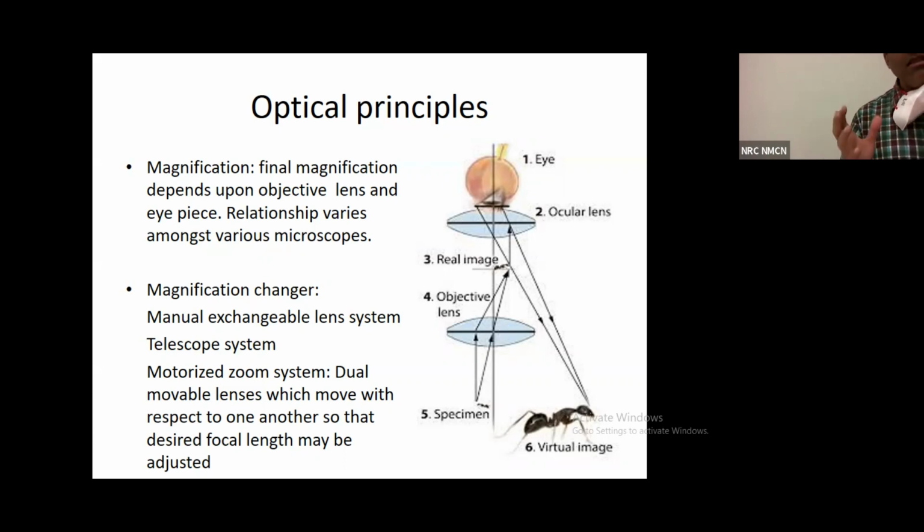Now, there are ocular aids that provide fixed magnification, which ENT surgeons and plastic surgeons use, known as loupes. I don't know whether you have seen loupes or not. It is simply a pair of specs, and there are two lenses fit onto the glasses. But the problem with them is that it is a fixed magnification. It can magnify to 1.2 or 2 or 2.5 maximum. The advantage of using a microscope is that the magnification can vary depending upon your need. The usual microscopes have a magnification range of anywhere between 1x to 21x. That means it can enlarge the image to about 21 times.